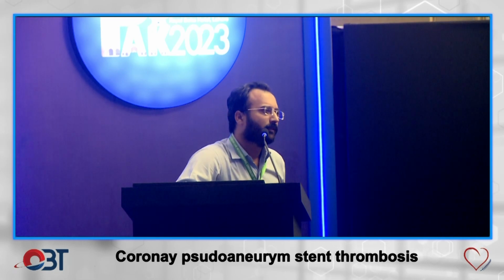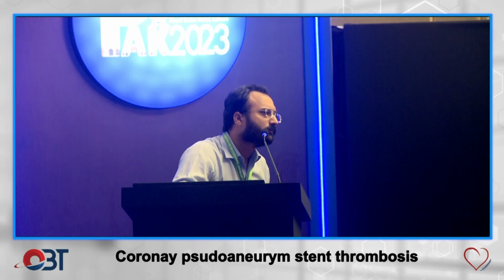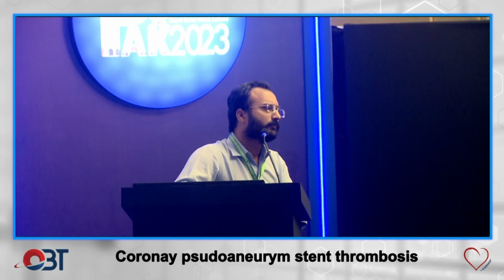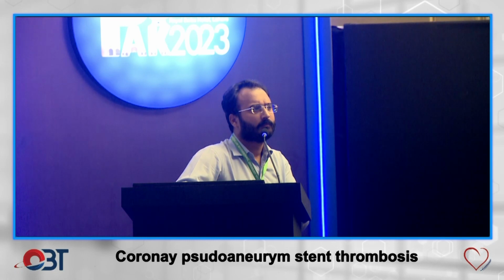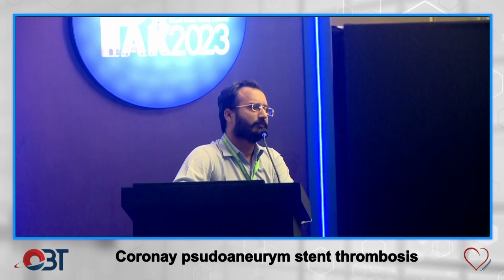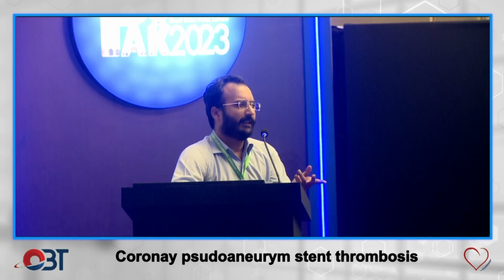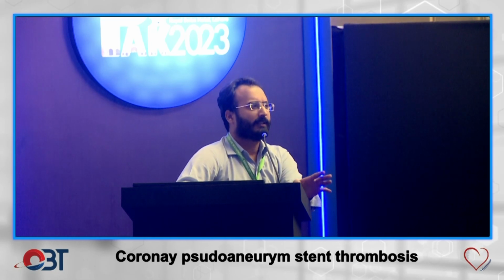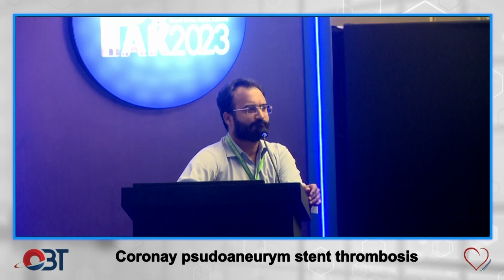Sir, second question, please. The stents, they landed in the plaque. So once you stented the stenotic segment, the second stent landed in the plaque. And that's the reason why, if you look at the final angiogram, you can see that there is post-stent stenosis, which should be hemodynamically significant. I don't know whether you did the IVUS or not, but it seems to be significant. Sir, at that time we had no IVUS available. IVUS catheter was not available, so sure we should do this.